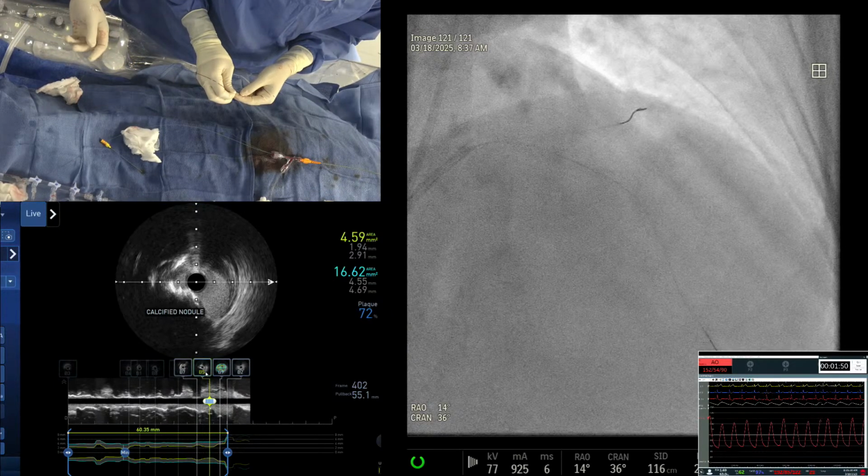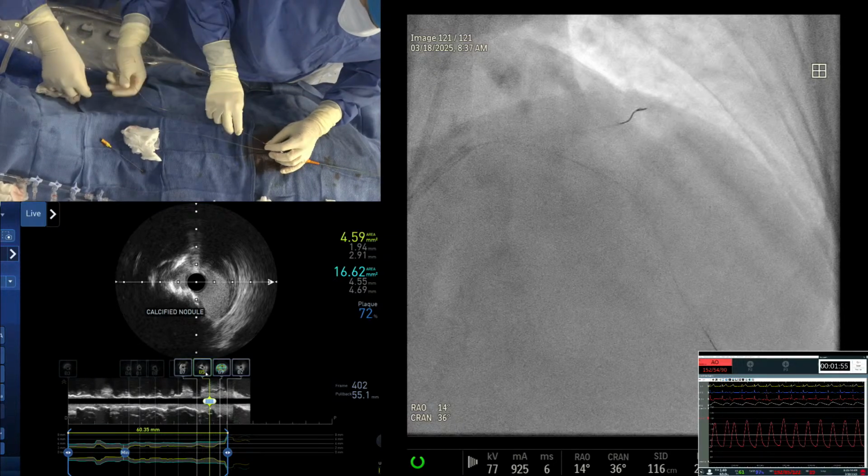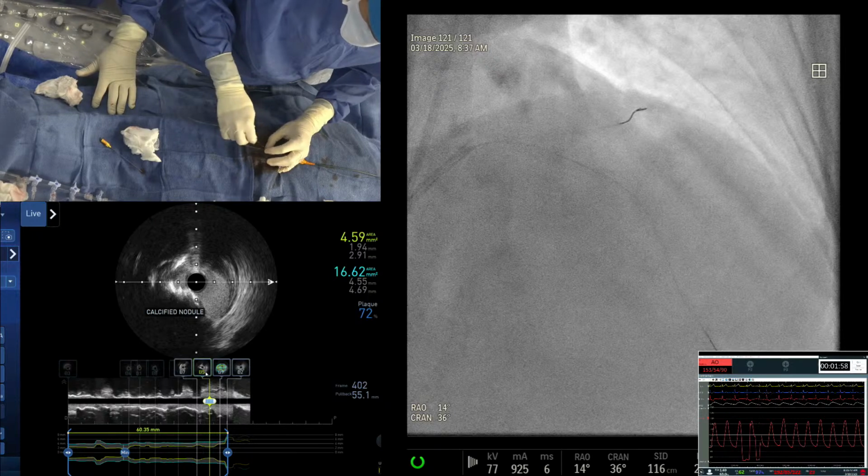Two wires cannot go just there, at the level of the diagonal. Remember, you cannot go beyond the diagonal. So this one, I would say just go with the high pressure. There's nothing wrong in that.